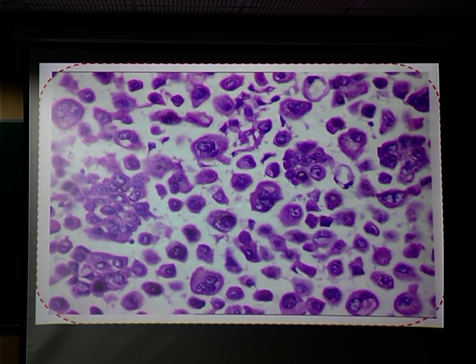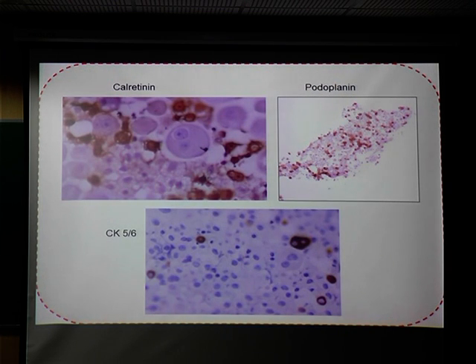He prepared a cell block out of this specimen, and here you can see again a lot of malignant cells which cannot be further qualified, but they are looking like epithelioid mesothelioma, and immunochemistry was done. Calretinin and CK5/6 were done. Now these two stains, we know that they are not very specific for mesothelial cells or mesothelioma, but if you add the stain of podoplanin, now podoplanin is a new marker coming up, and it was basically found in the lining cells of the lymphatics.